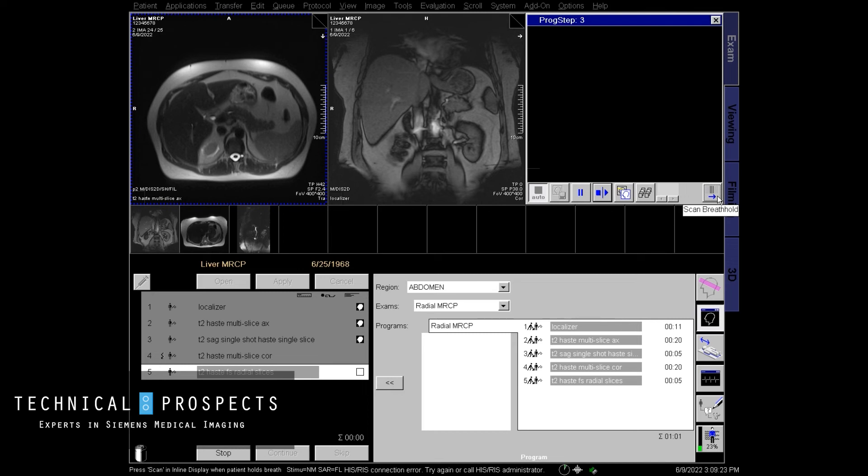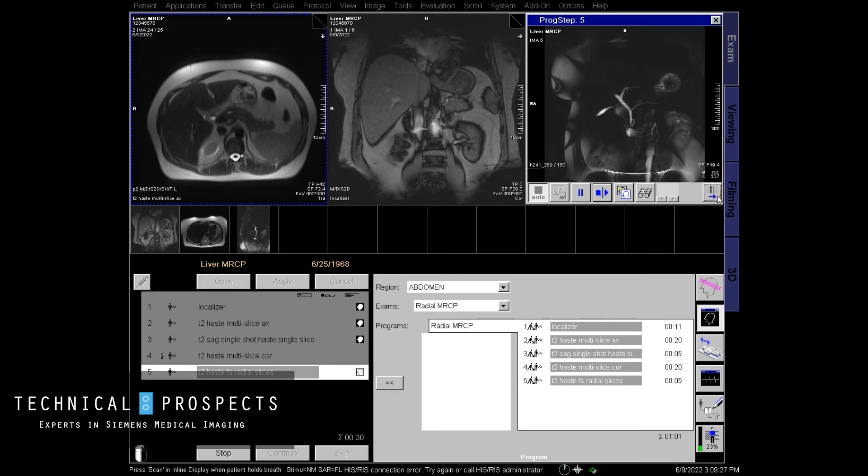Okay. Go ahead and taking a breath and hold it. And I'm going to be doing this five times and you're going to see this biliary tree turning in a circle.